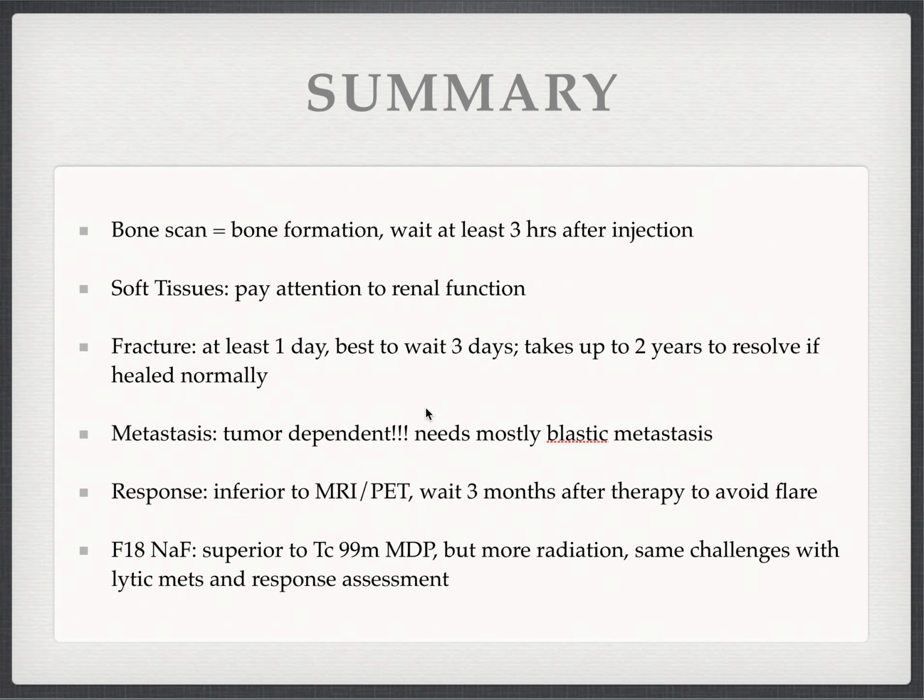All right, so in summary, bone scan is bone formation. We generally should wait at least 3 hours after injection to get some images. Pay attention to soft tissues and renal function. For fractures, at least a day, best to wait 3 days, and takes generally up to 2 years to resolve after the fracture heals. Detection of metastases is highly tumor dependent. We primarily use it for prostate and breast cancer, and we need blastic metastases. Otherwise, we're detecting tumor response to bone response to pathologic fracture.